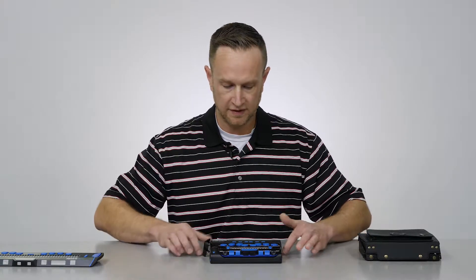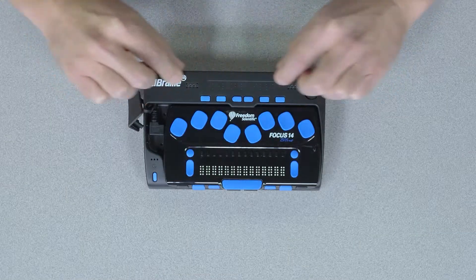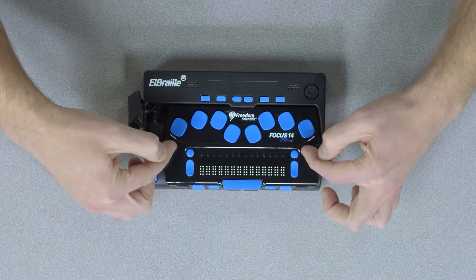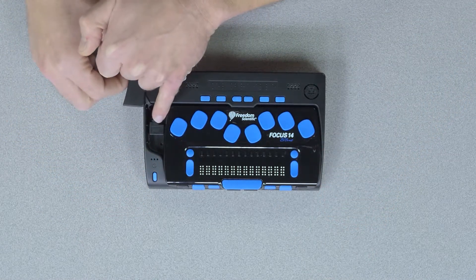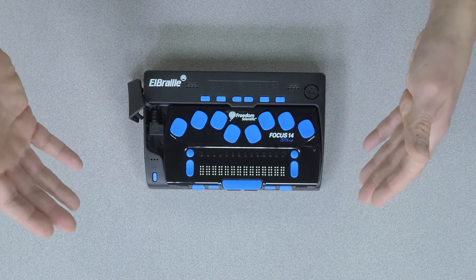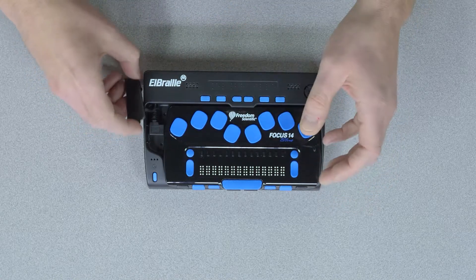The LBraille itself is the docking station for the Braille display. The LBraille surrounds the Focus 14 and the Focus 14 actually docks into the LBraille. Here to the side there's a micro USB cord that when you first insert the Focus 14 into it, you have to insert the cord in first — there are instructions on this.